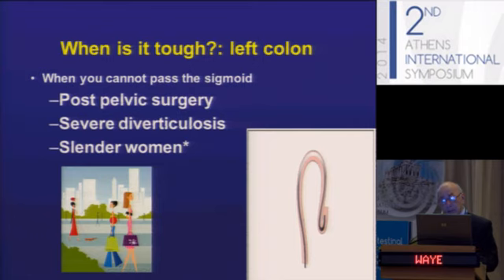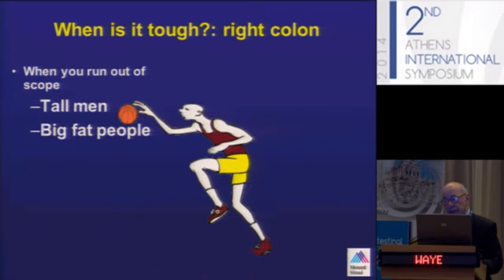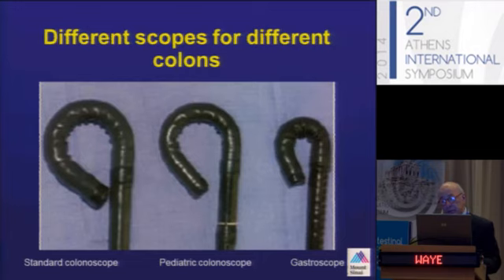So I think that the left colon is where you're going to get in trouble with patients that meet these criteria. How about in the right colon? In the right colon, it's difficult when you run out of scope, and that's in tall men or big fat people. So these are the groups that you're going to run out of scope with, and you need a different scope for these than you do with the slender women.